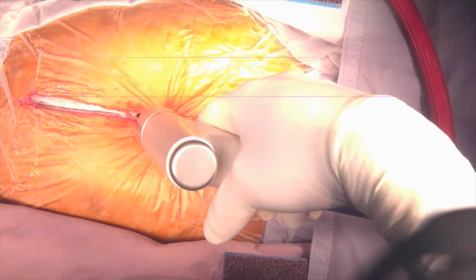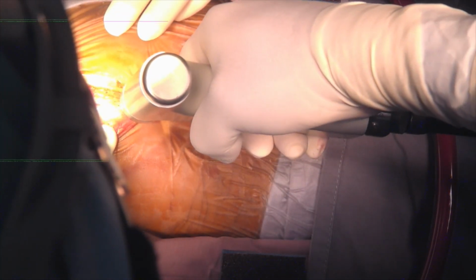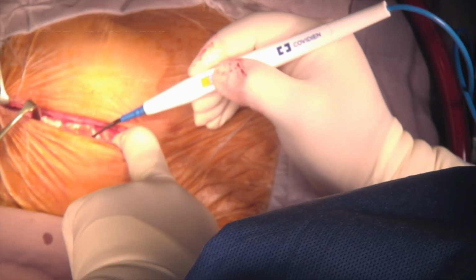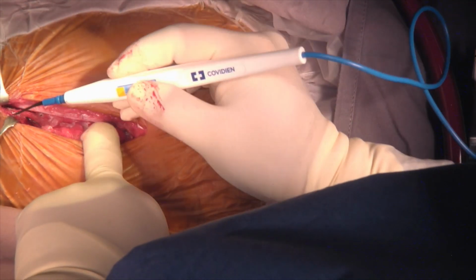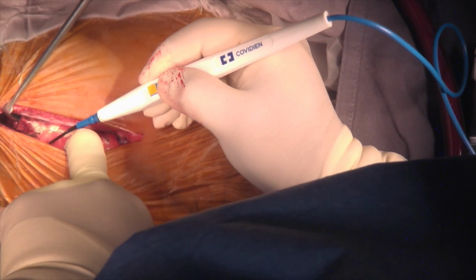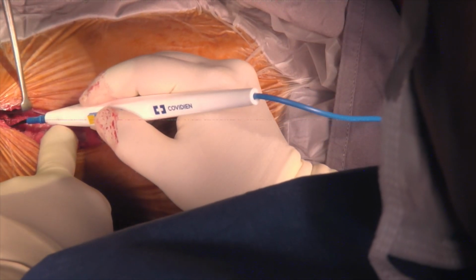The operation starts with a midline sternotomy. The patient's sternum is divided in the midline with a sternal saw from below upwards. The space behind the sternum is gently packed with sterile surgical gauze, and the cut surface of the periosteum of the sternum is treated for haemostasis.